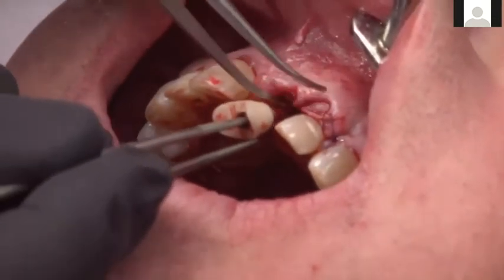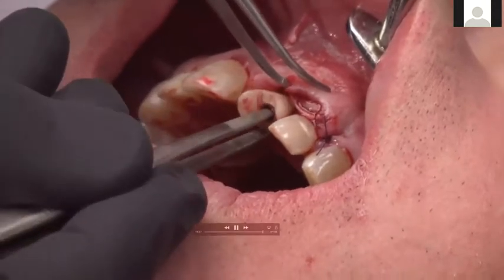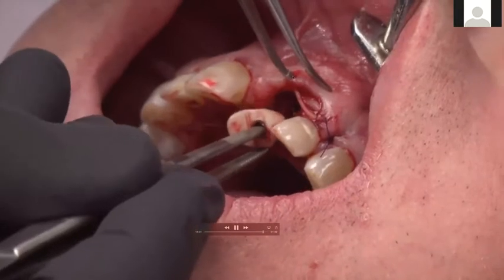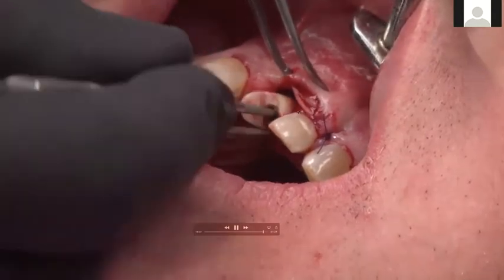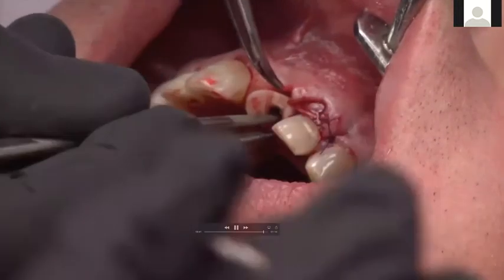You can see here, in the meantime, while Mike was fabricating this custom tissue former, I went ahead and did a connective tissue graft here on this lateral and canine, and also tunneled underneath here. Now I sutured all of this except this area right in here, because I wanted to make sure to leave enough space so we can insert this custom tissue former.